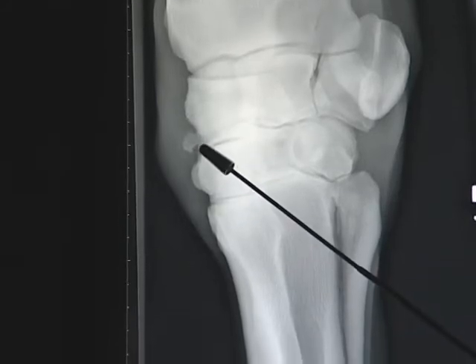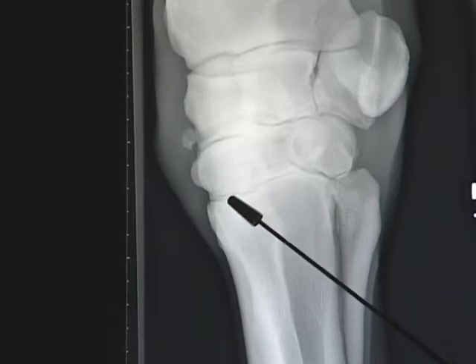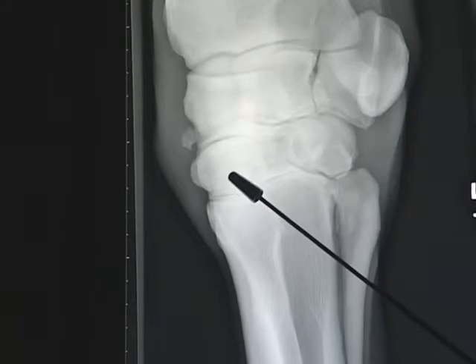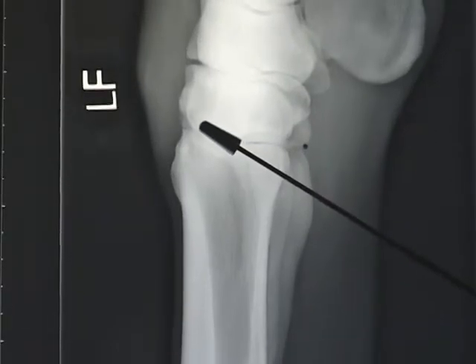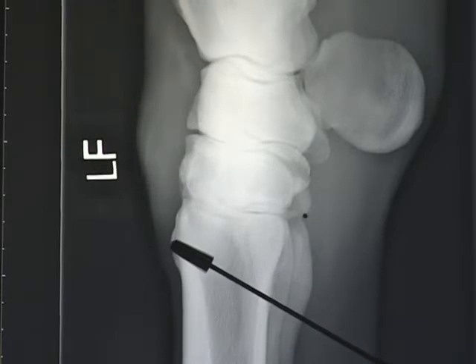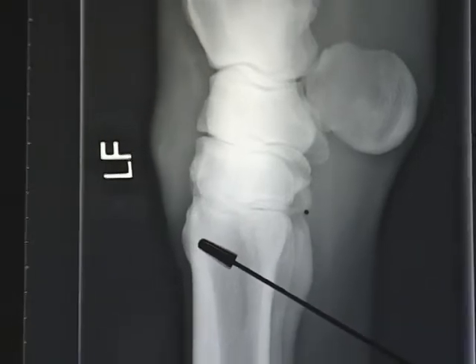Now, what does oblique mean again? Oblique means they're coming off at an angle, like a 45-degree angle, trying to pick these things off. Because sometimes if we come back over here to this other view, a straight lateral, you don't see our chip at all. You don't see our osteophyte. And this is the importance of getting all of the views when you're trying to have a horse diagnosed for lameness, because sometimes one view doesn't show the entire story.